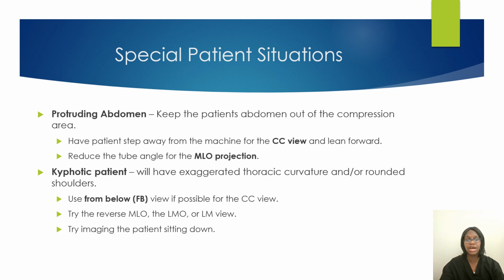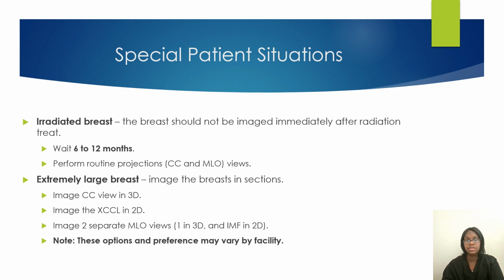And then you have kyphotic patients. At my facility, we can put in that it was difficult to position a patient because they were kyphotic. You can put notes in like that. If it's very difficult to position them, watch your tube angle so that you do not hit their sternum bone, or so that you make sure they do not fall, because whenever you are positioning patients like this, it may or may not be challenging for you.